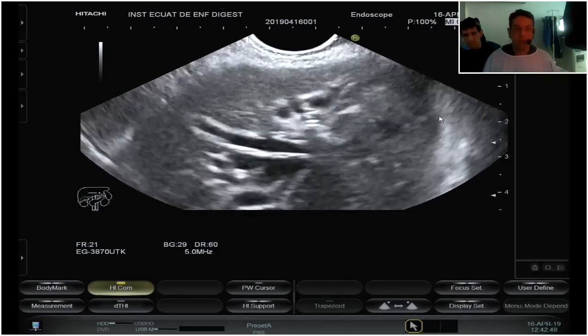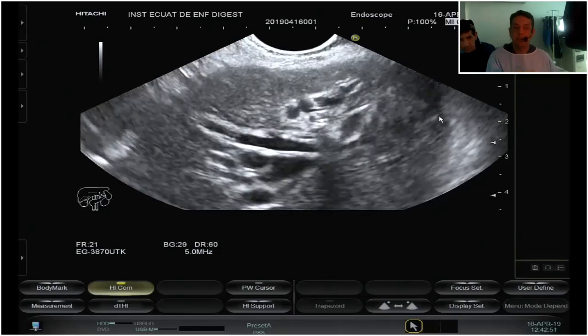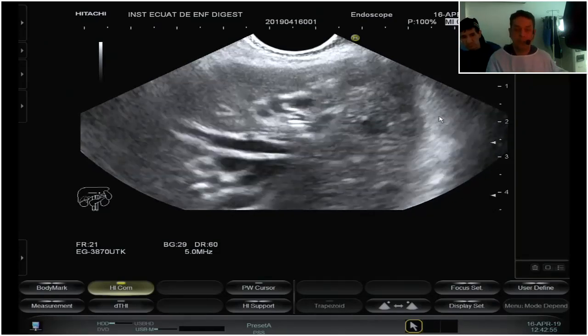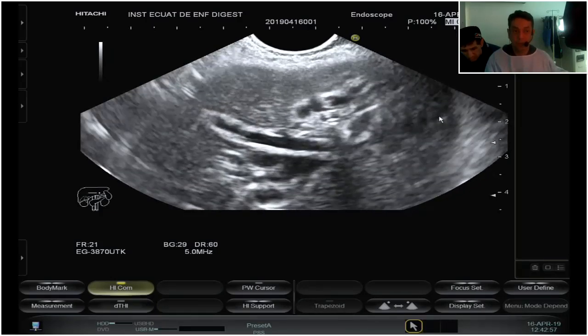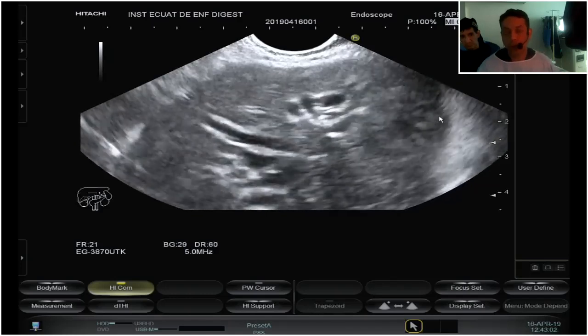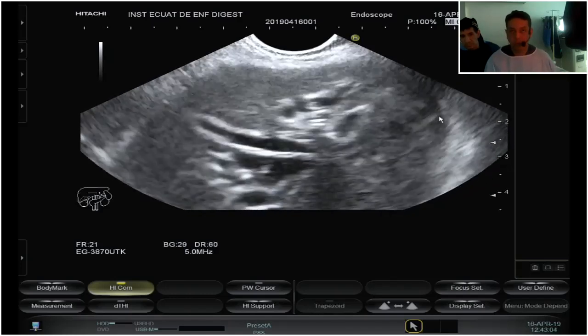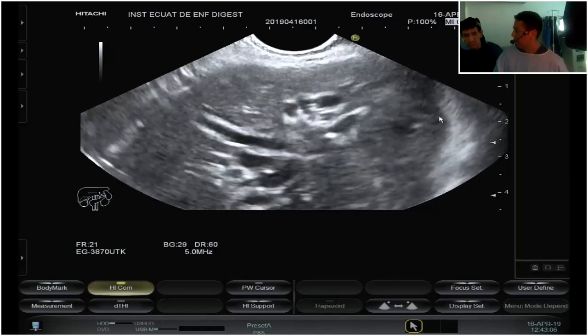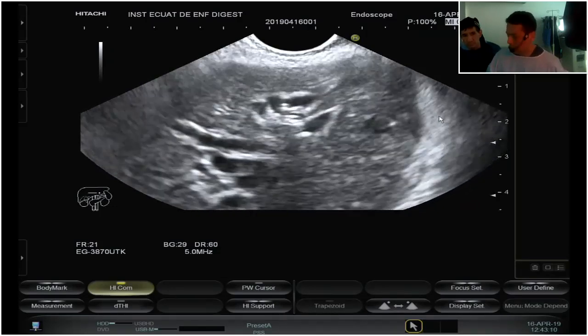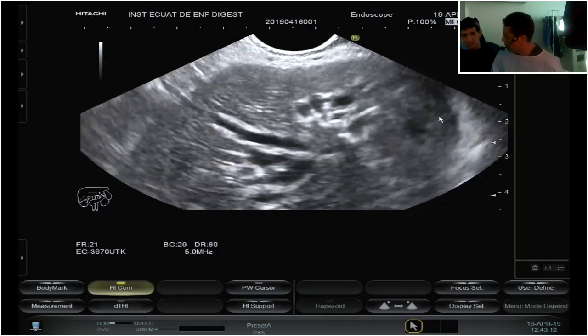Moreover, if I see air, probably there is no stenosis, there is no obstruction, even if there are some stones inside. So I can have the chance to try to treat by US in the anterograde way, doing a balloon dilation and then pushing the stones.